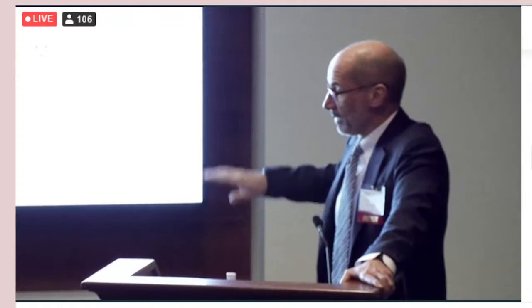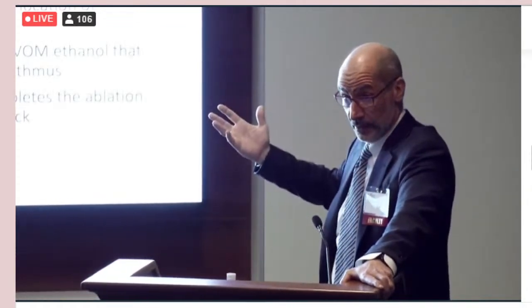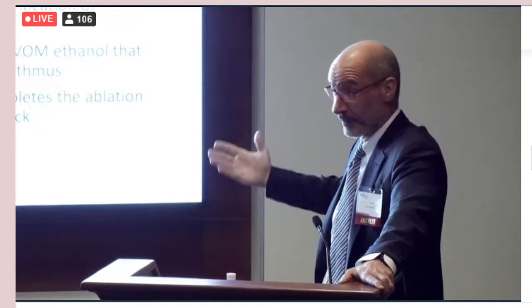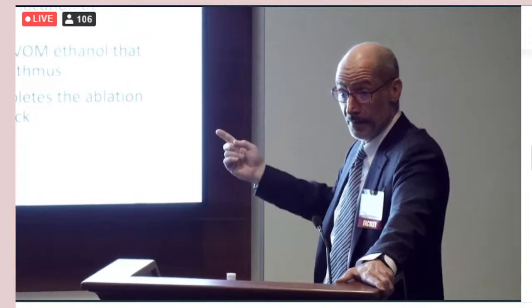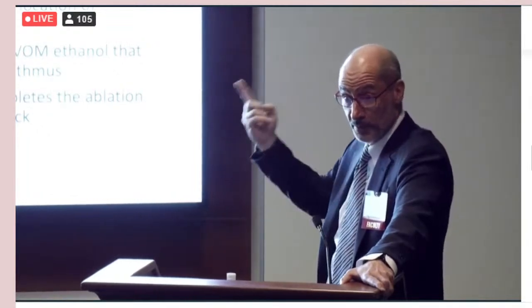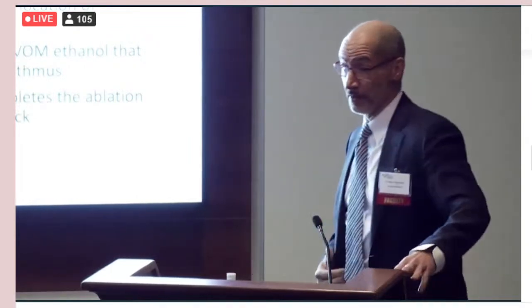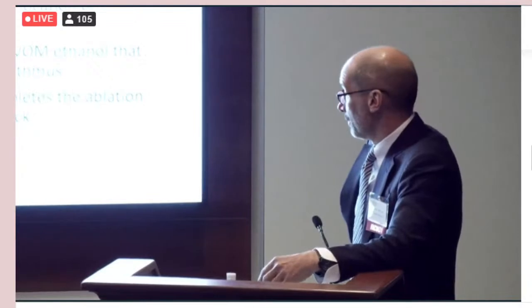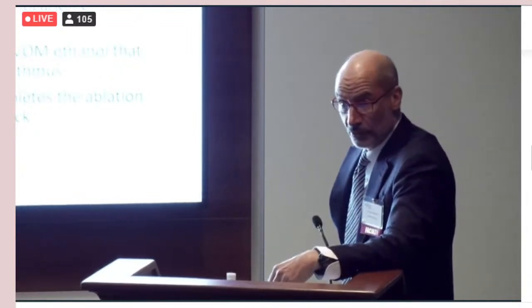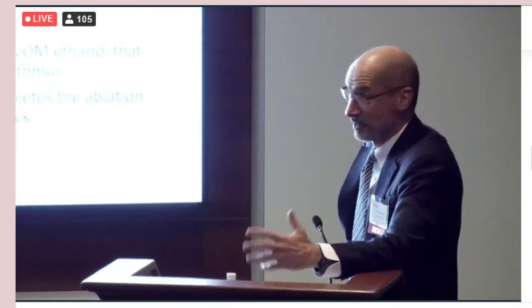I didn't show you, but the second paper we published on this was looking at redo cases and patients that had been ablated extensively. All of them had scar in the mitral isthmus, and all of them had very robust signals when you put a Cardima catheter in the vein of Marshall. So transmurality in the ridge is hard to achieve. It's possible that with electroporation or the Affera catheter, we don't need any of this. I don't deny that, but that's a hypothesis.